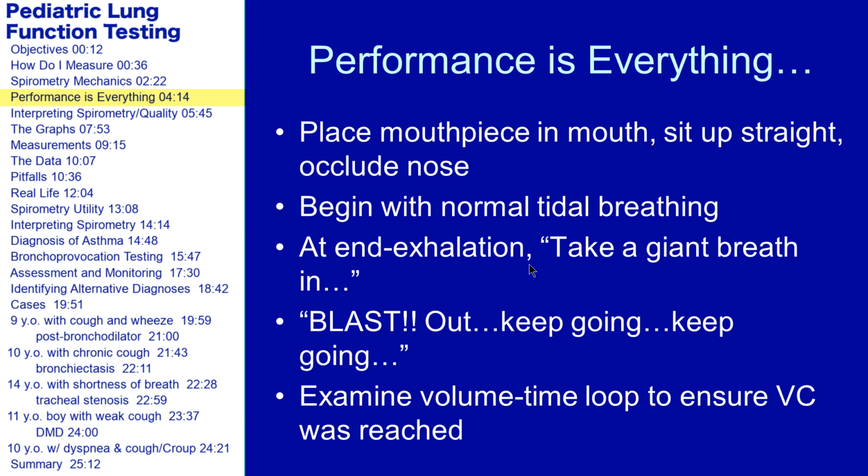out, but then also getting them all the way down to the residual volume so that you're really measuring their total vital capacity. And after each one, you should examine the flow volume loop as well as the volume time loop to ensure that they plateaued their spirometry, and I'll show you some more about that.